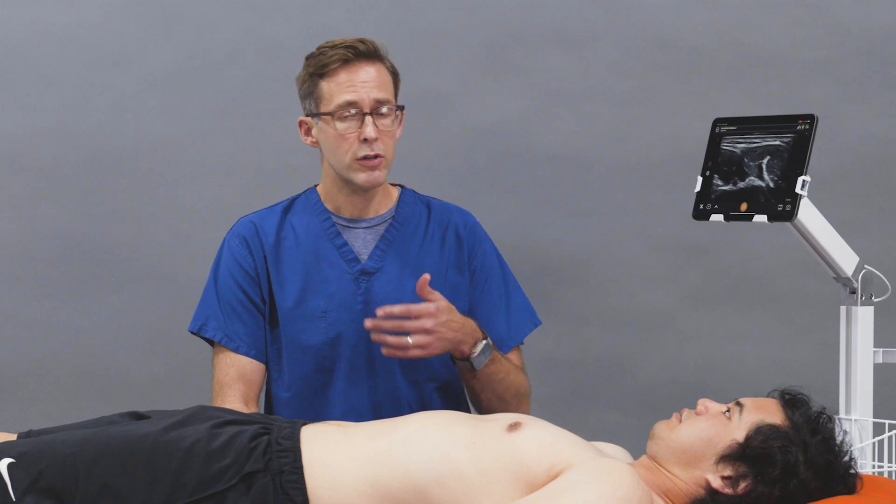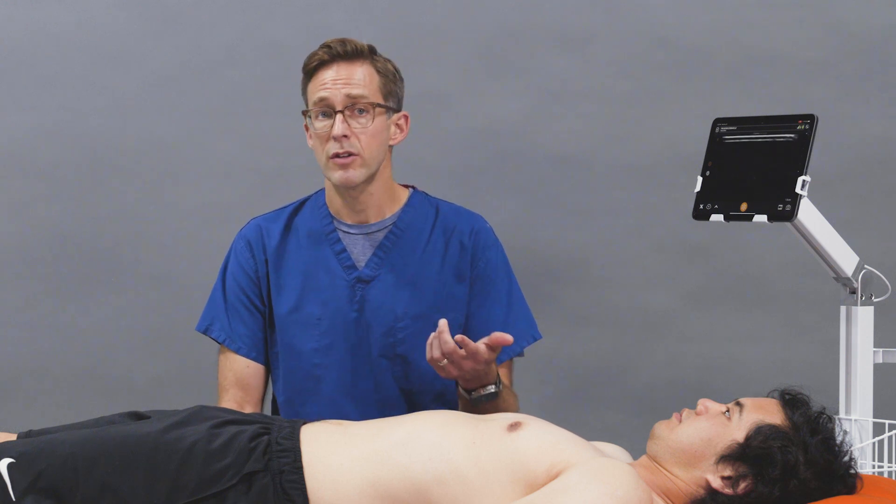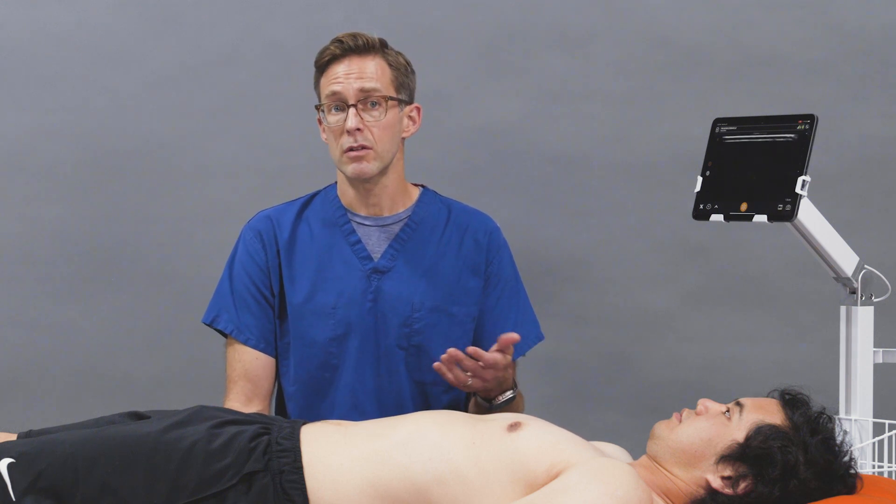You can perform ulnar nerve blocks blindly, but with ultrasound it improves your accuracy and can minimize your complications.